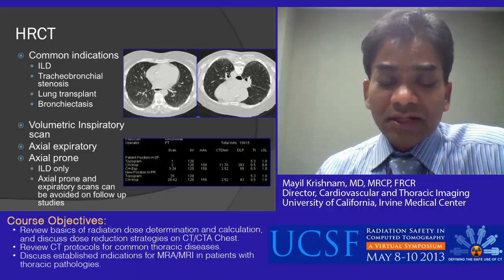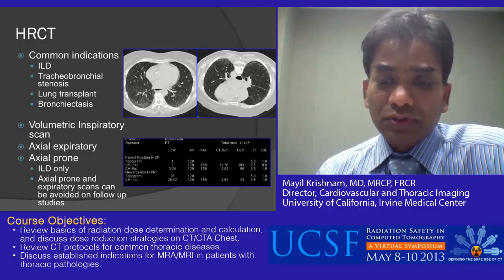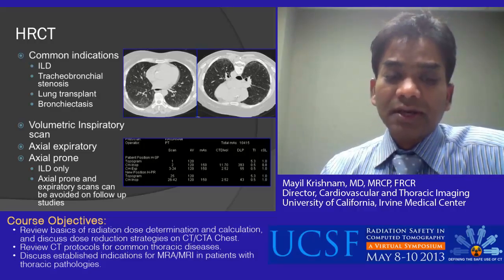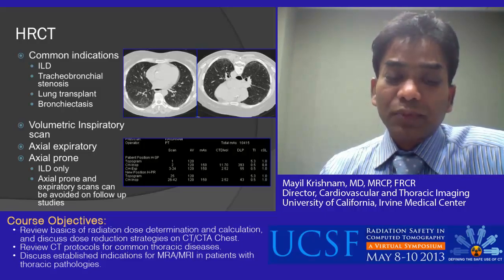Prone images would help to differentiate early fibrosis from simple atelectasis. However, on the follow-up studies with established pulmonary fibrosis, we don't need to routinely perform a prone scan.